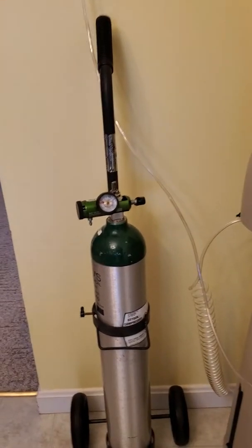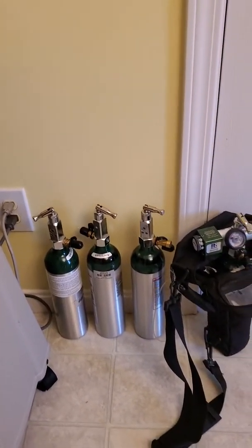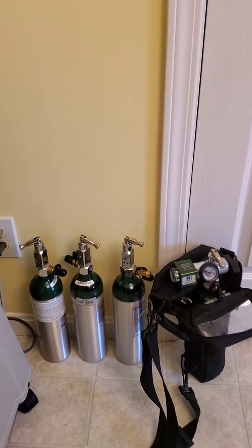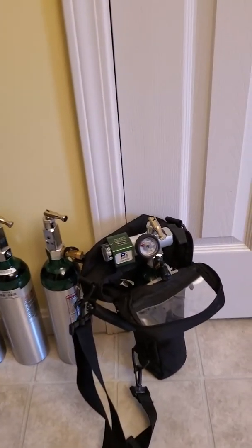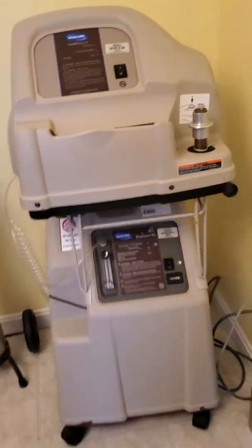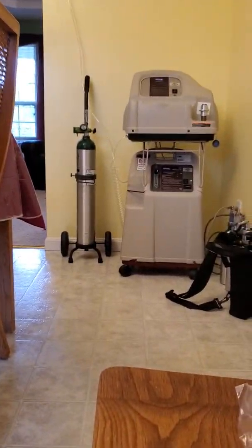A tank that you can drag behind you, and these spare tanks — the little tanks that you can carry with you. The regulator tells you how much oxygen is left in the tank. I'm going to show you this quick and easy. Along with that you'll need some tubing to make everything work.